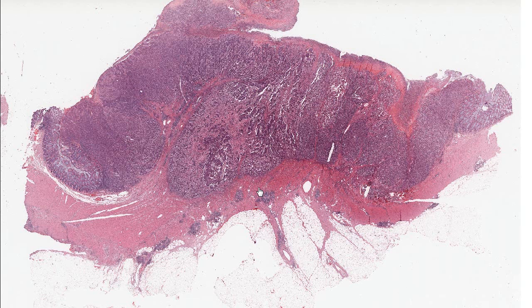I'm a pathologist at Duke University Medical Center, and this is a slide from the USCAP virtual slide box. It is a colon resection specimen. To orient you a little bit, we have the internal luminal surface of the colon, the external of the colon. The normal colon is composed of different distinct layers. We have a small amount of normal colon over here. We have the mucosa, the submucosa, the muscularis propria, and subserosal fat.